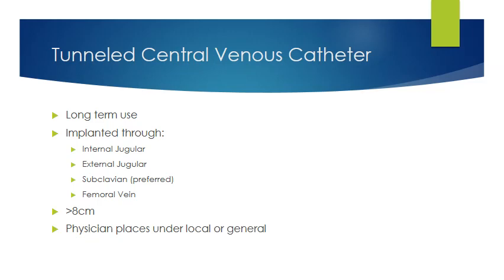There is actually a little cuff around the catheter itself, and that's why we insert it 3 to 6 inches into the tissue before it goes into the vein. That little cuff, we call it a Dacron cuff, has some anti-infective properties on it, like it's antibiotic coated or something, and that sticks into the subcutaneous tissue. It attaches to it, and then it starts to heal and scars up, and so that's what holds that catheter in place in the subcutaneous tissue. It helps to stabilize that catheter, and it also minimizes the risk of infection. So that's how those catheters are put in.